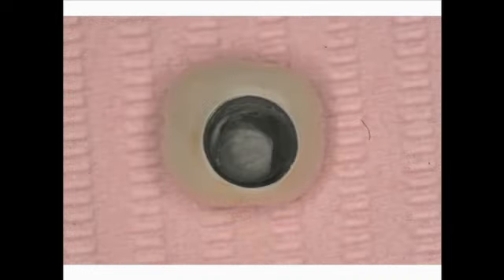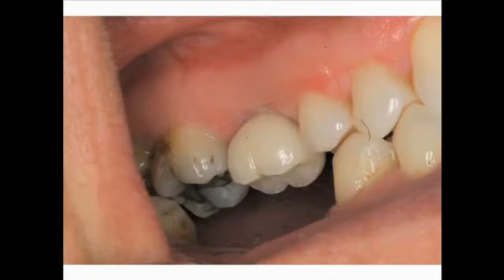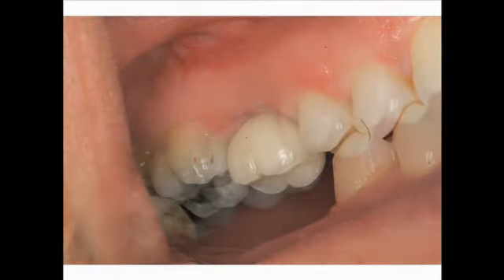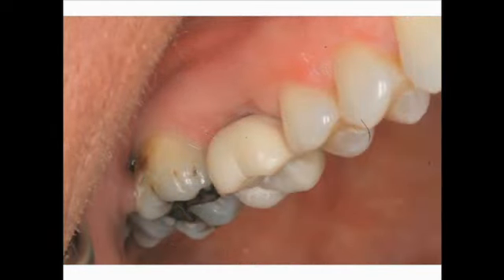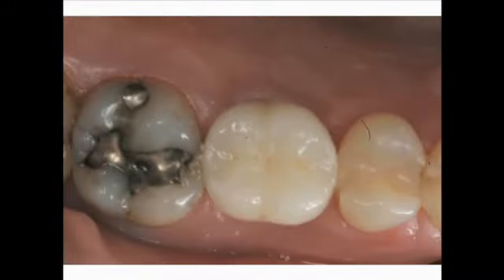That's zirconia. Here's a PFM. You can see just a traditional PFM crown and the bruxer solid zirconia crown, which is rather opaque. The zirconia crown creates a warm essence. The PFM was much more opaque. And the bruxer crown was opaque but very durable. So we decided on the zirconia, and we cemented the zirconia crown into position.